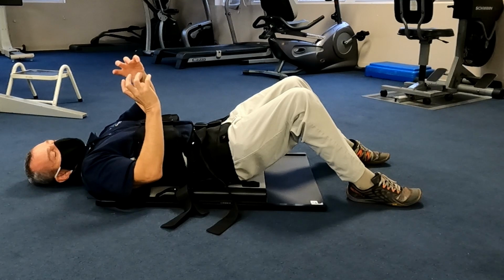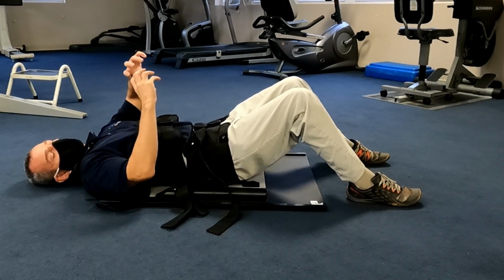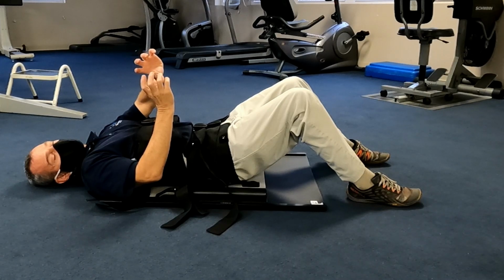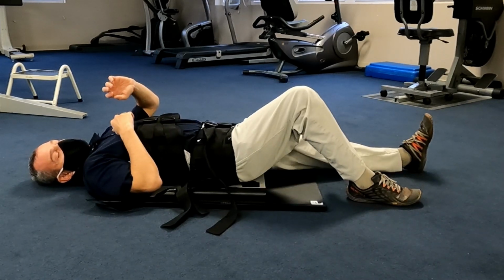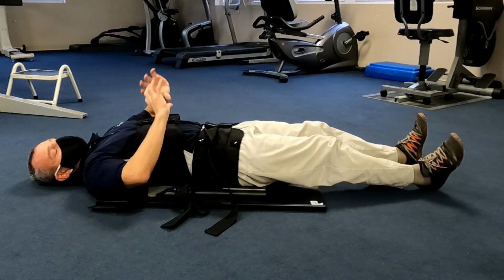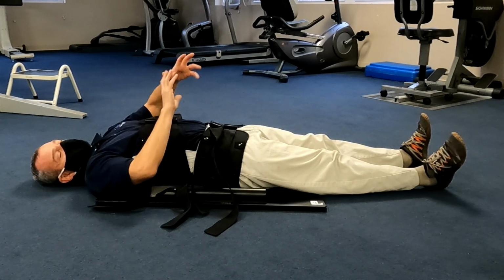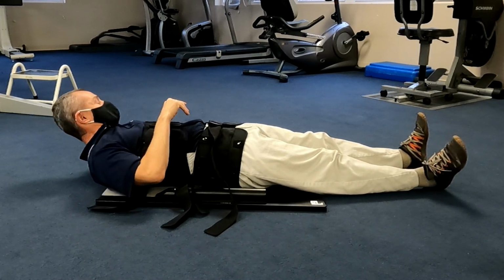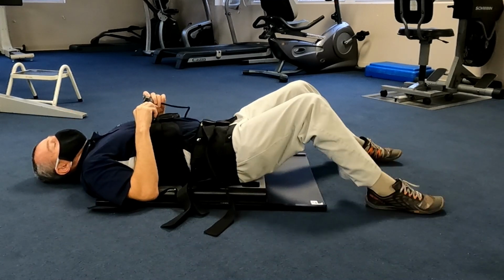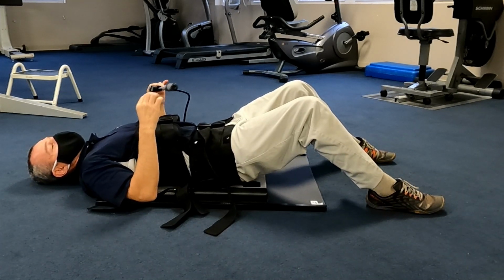If we think about the posterior spine, if we go into a little bit of a posterior tilt, I'm already opening the space a little bit. If I have somebody that does better in extension, then I'll have them with their legs straight, because that instantly is going to pull me into an anterior tilt. So it just takes a little bit of kind of experimenting. And then from here, so I get my little posterior tilt, I start to pump.